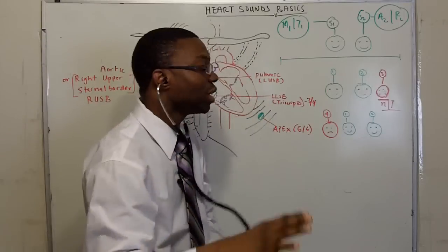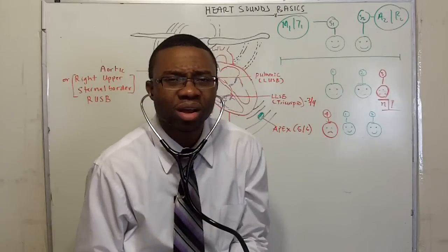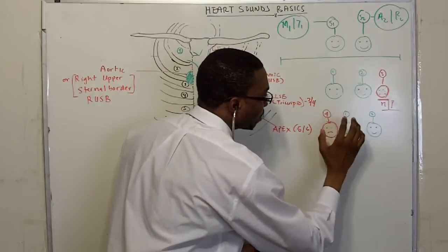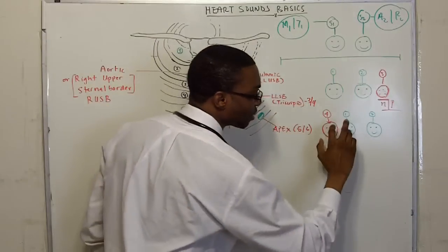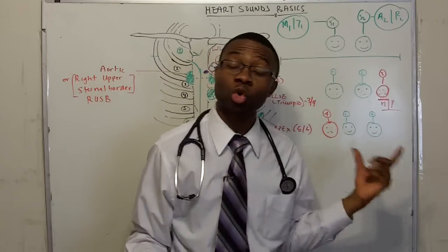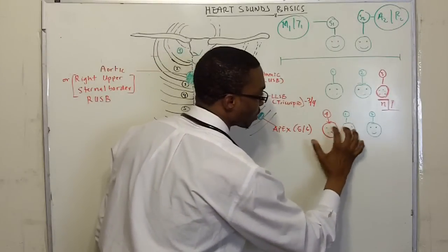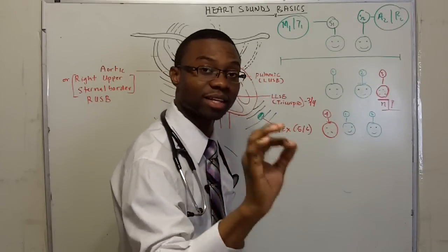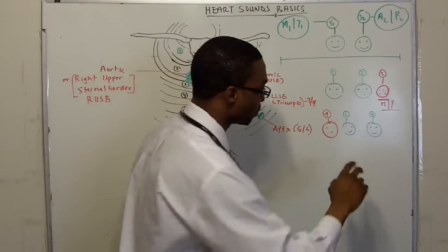However, if you're going to do S4, people often use Tennessee, but I don't know what they're talking about. This is what they're trying to say. Can you hear that? Now, that's absolutely different, right? Because it sounds like this. Now, S4 is so close to S1 that when I do it really fast, you might not even notice. Look at this. Because it sounds like Tennessee, Tennessee. S4, S1, S2.